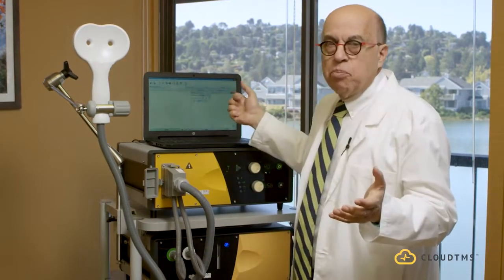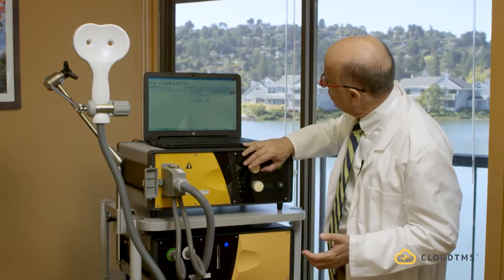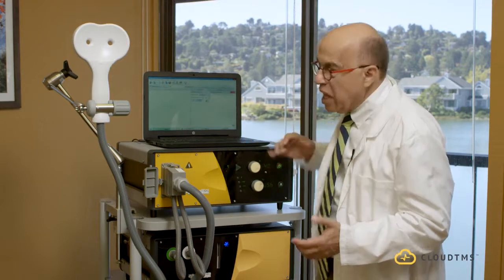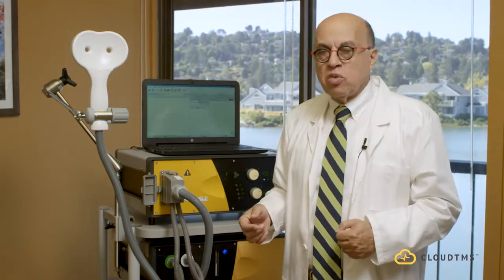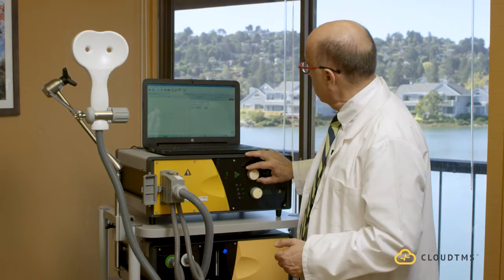amplitude from here, and I can make it 42 or 44. I'm trying to find out the lowest possible level that I can stimulate the patient on the left side of the brain to see a thumb movement. That's how you calculate the motor threshold. And when you say 120% of the motor threshold, you do 120% of that. So now imagine that I'm doing the motor threshold, and I found that the patient's motor threshold is roughly at 50.